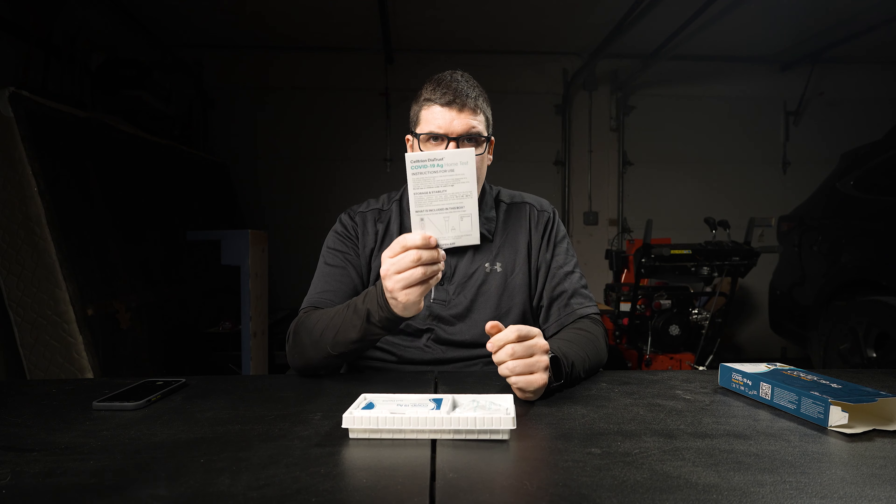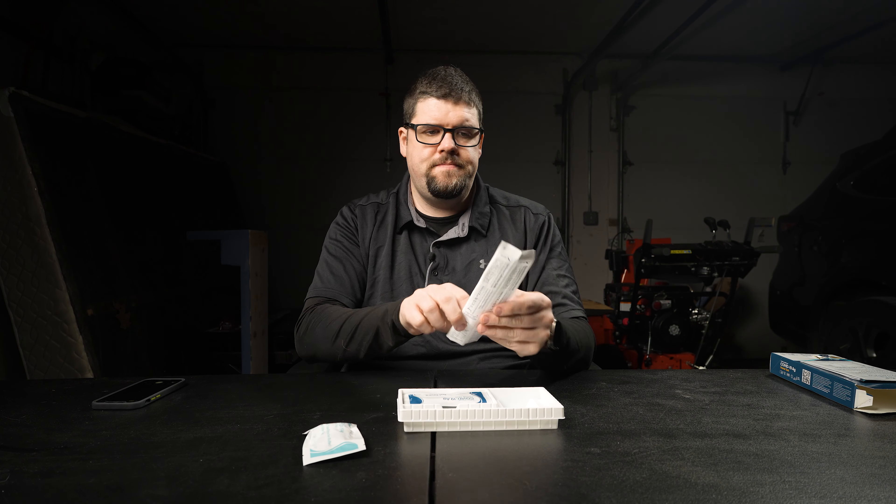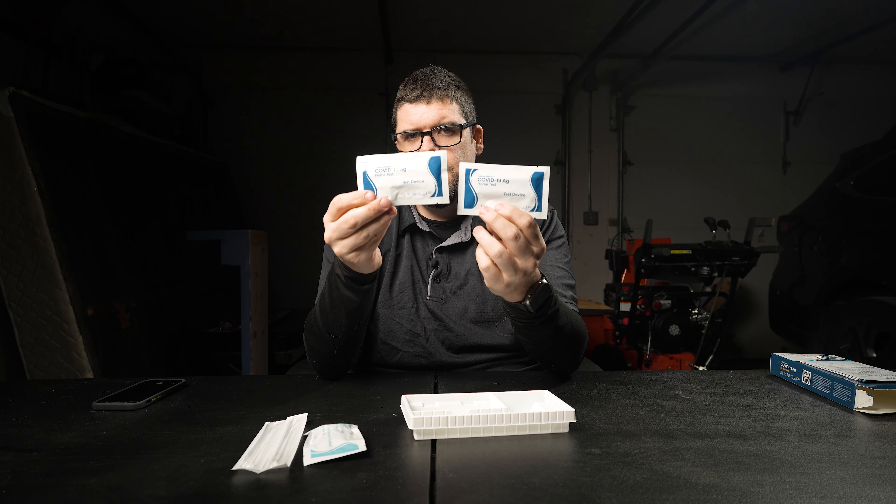There's a little tabby thing you put your finger through and then you just open it up. Once you get that, you're going to pull out the tray. You have your instructions, which we're not going to use because I've done this test before. Here you have your test tubes and caps, and your swabs — one, two. This test includes two tests: husband and wife, or today and tomorrow. And then you have your two Celtron test strips.